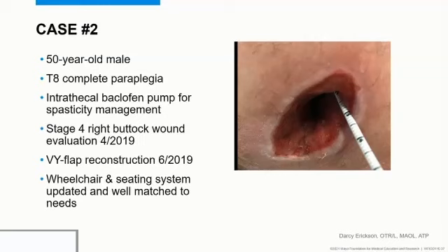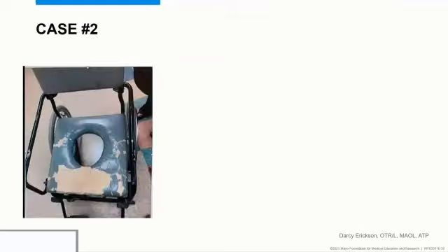He was very active, worked full time, and so it was like, well, where did you think this came from? And I said, well, what's your bowel care? What do you use for your bowel care and for showers? So his wife sent me this. And I was like, come on. I said, what about this picture looks bad to you? And he said, well, only the front's broke.